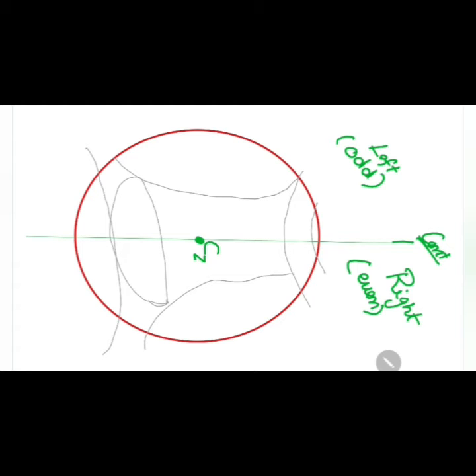Right? So next electrode is placed here, which is again center, and the next electrode is placed here. Now this should obviously be named C, but what number should be given here? We cannot give number 1, that would be a mistake, because this law states that on the right side the number should be even. So can we give 2? That again will become wrong.